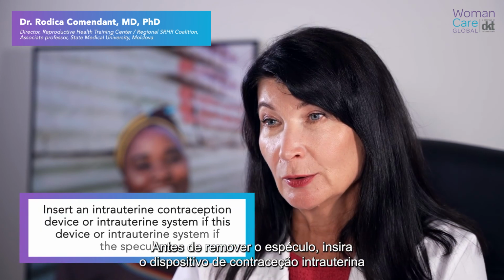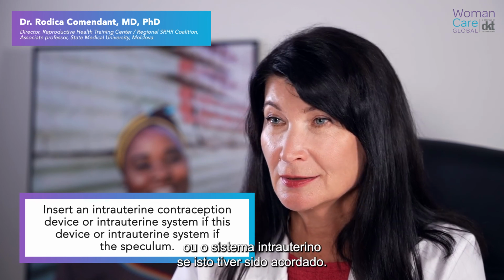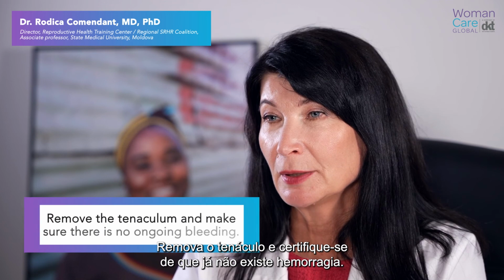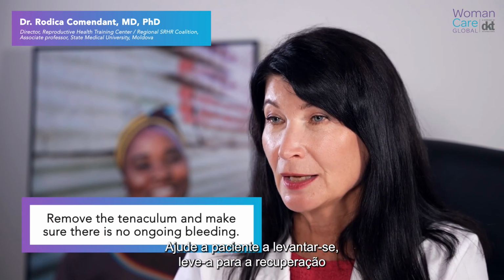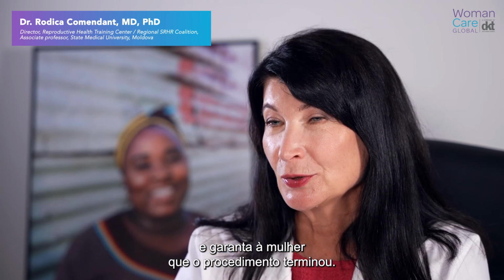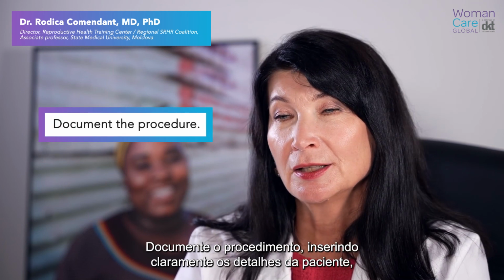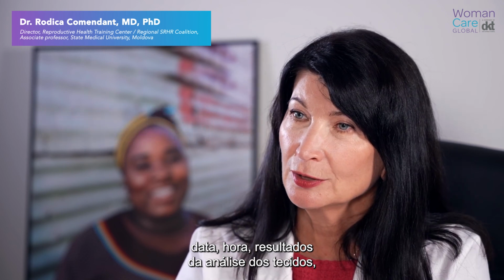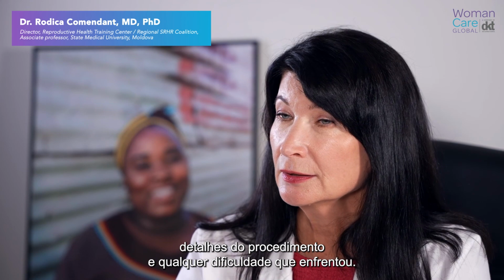Before removing the speculum, insert an intrauterine contraception device or intrauterine system if this has been agreed. Remove the tenaculum and make sure there is no ongoing bleeding. Help the patient up, escort her to the recovery, and reassure her that the procedure is finished. Document the procedure, clearly entering details of the patient, date, time, findings of the tissue examination, details of the procedure, and any difficulties encountered.